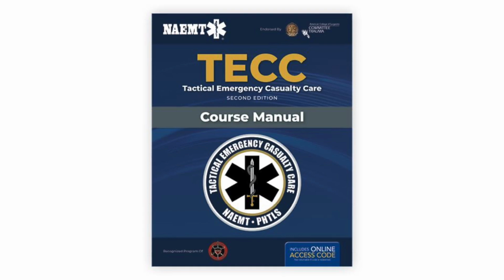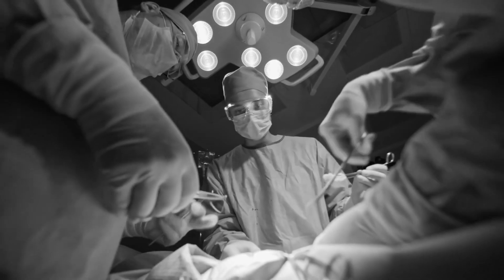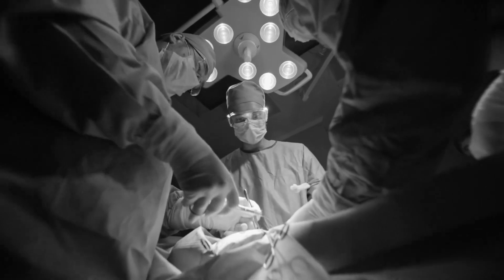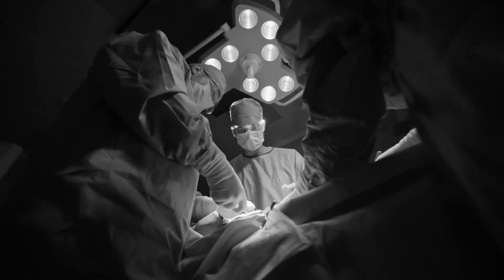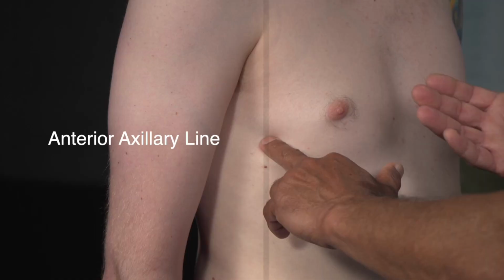If you look at the TECC criteria, the ATLS criteria, and you speak to the trauma surgeons, pretty much everybody is telling us that our new anatomical landmarks really need to be that anterior axillary line, not necessarily the mid-axillary line. So if you look at your protocol books right now, the preferred spot for needle decompression for tension pneumothorax is the mid-axillary line in the fifth intercostal space. However, there are some issues with that we've noticed.